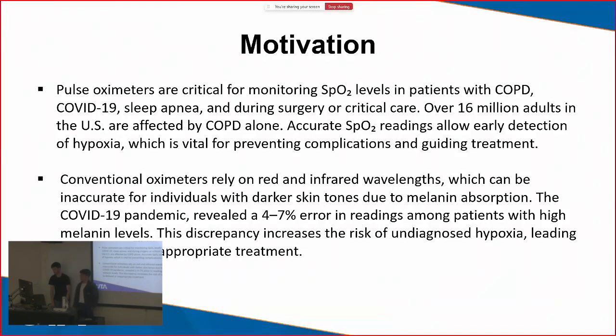Conventional oximeters rely on red and infrared wavelengths, which can be inaccurate for individuals with darker skin tones. During the pandemic, about a 4 to 7% error was read in patients with higher melanin levels.